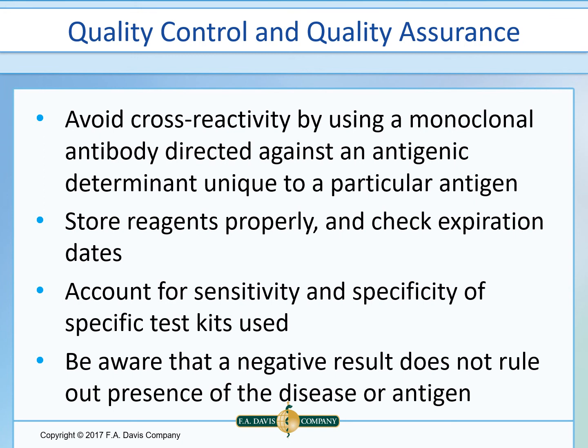Major advantages of agglutination reactions include how rapid they are and how they are fairly sensitive, and that samples containing an organism do not need to be viable in order to test positive. Although there are advantages to testing, it's important to be aware that a negative result does not rule out the presence of the disease or antigen.